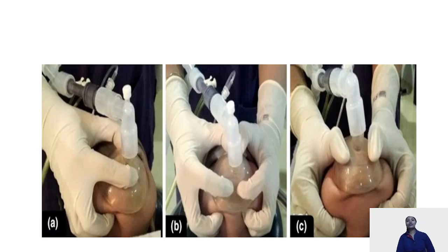Now, how do you actually hold the face mask? There are certain techniques to hold it. The very first technique which you all can see is the single hand technique. I hope you all remember the head tilt and chin lift maneuvers.